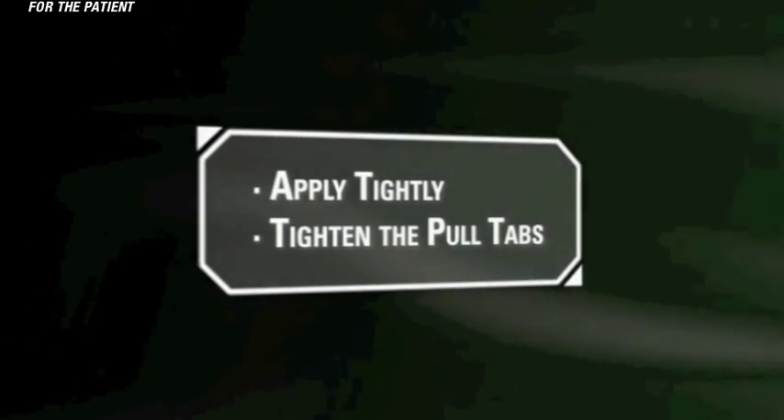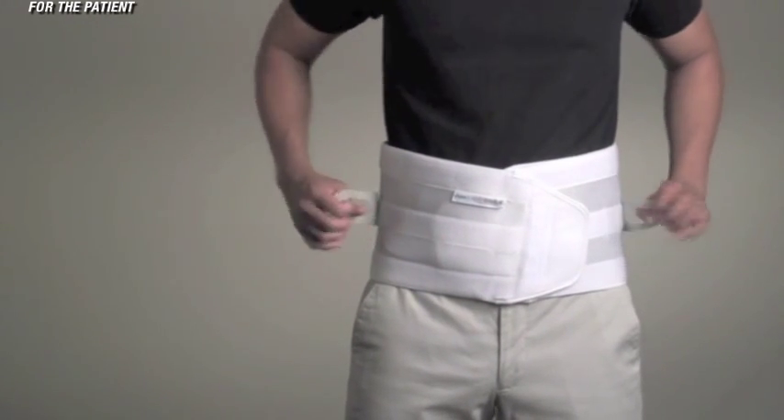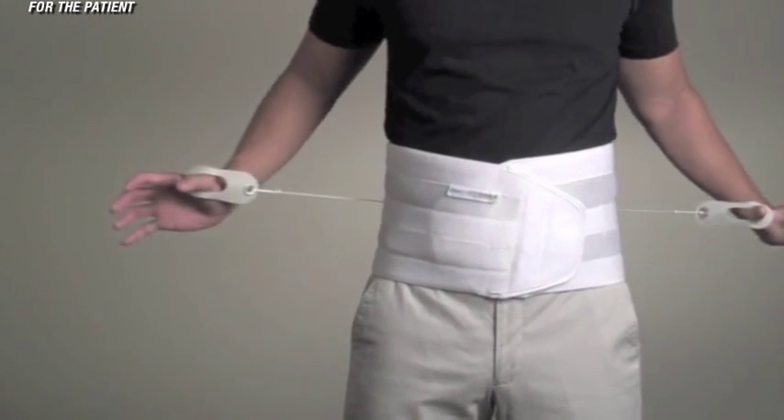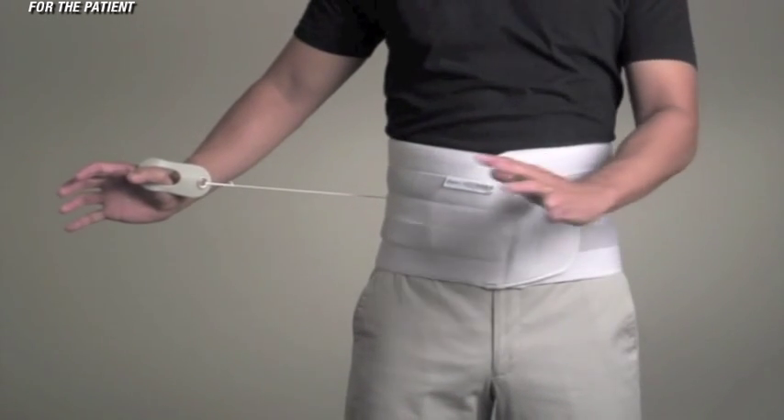Second, tighten the pull tabs. Once properly fit, peel the pull tabs away from the brace to tighten. When the desired compression is achieved, simply touch down the tabs to the loop Velcro on the Quickdraw.